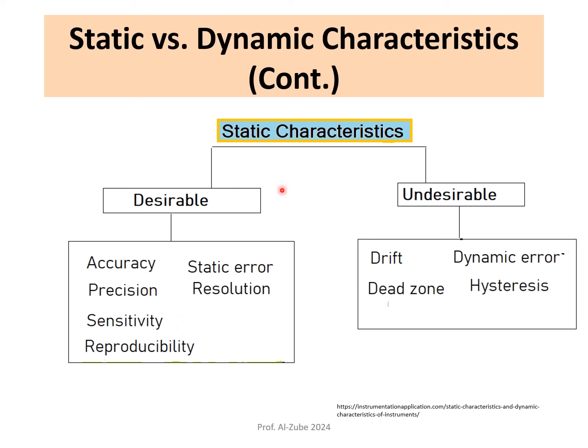So those are the things that you would like to look for when you buy a medical instrument, or when you design a medical instrument. You need to report those, and you need to report for the Food and Drug Administration. And those are the things that actually affect the price tag for your instrument. So those are static characteristics. Again, static means that the input is DC, zero frequency, or very low frequency changing.